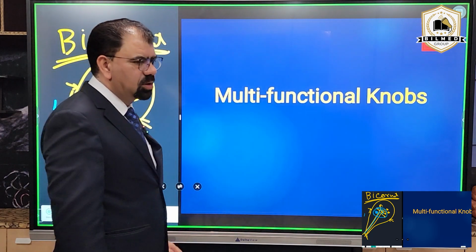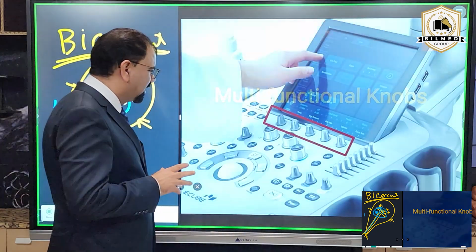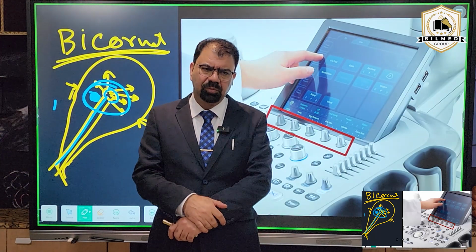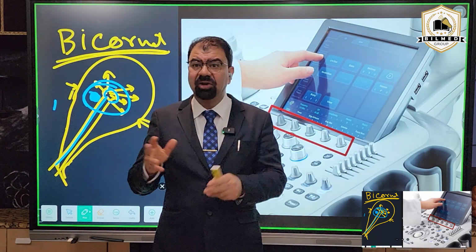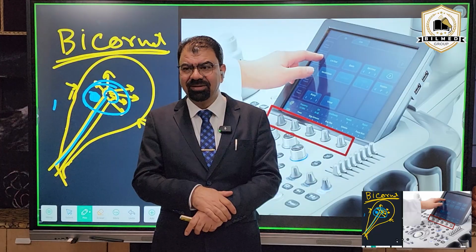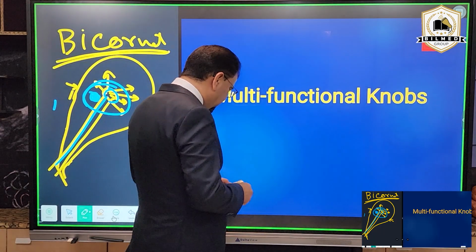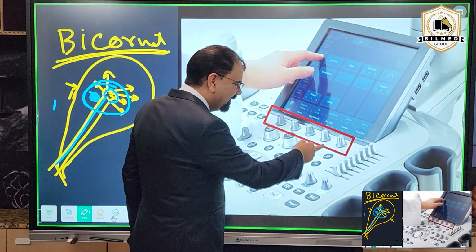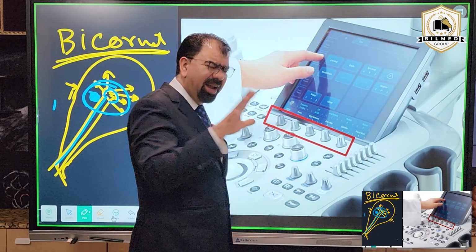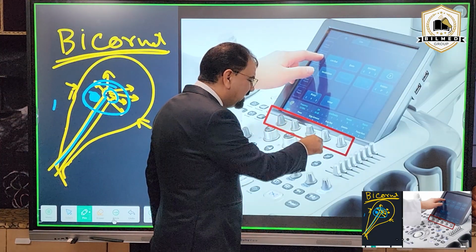Okay, now, Dr. Madhuri, last question for you. Multifunctional knobs. What I mean by multifunctional knobs, Dr. Madhuri, which machine are you having? Tell me. Sir, Mindray DC60, sir. Mindray DC60, a very good machine. Each and every machine is good, but she has a high-end machine, but now she will tell me whether there are some knobs over here, just beneath the display, where I am having about 5 knobs, and nothing is written what for these knobs are.